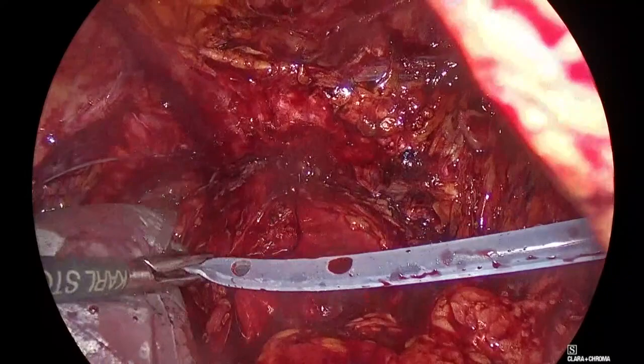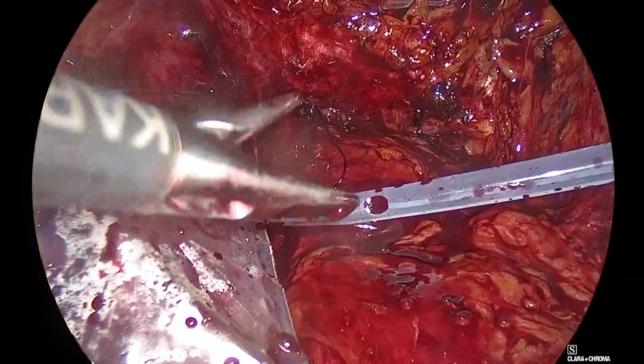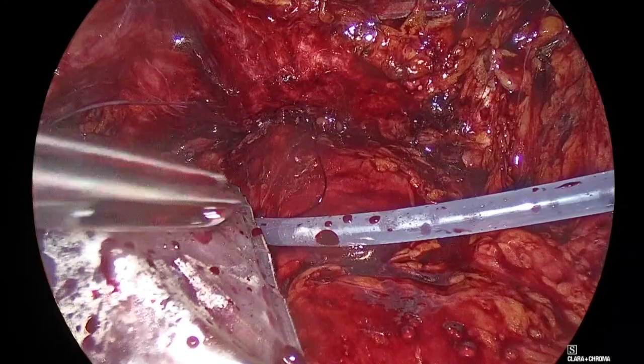So, Alan, do you hear the question? Do we fix a hernia on the right or not in this case? Good. I wouldn't, if you've got a big hole in the peritoneum. There's a hole in the peritoneum. I'll show you laterally now.